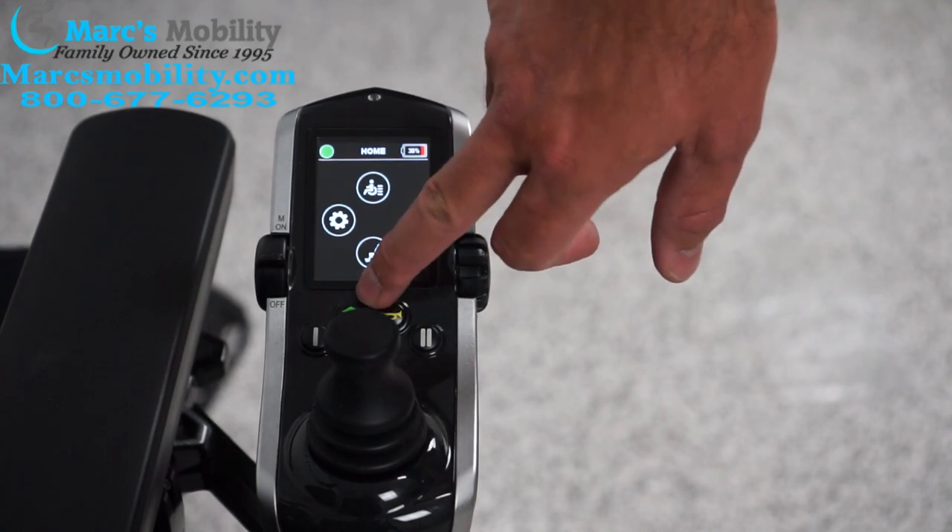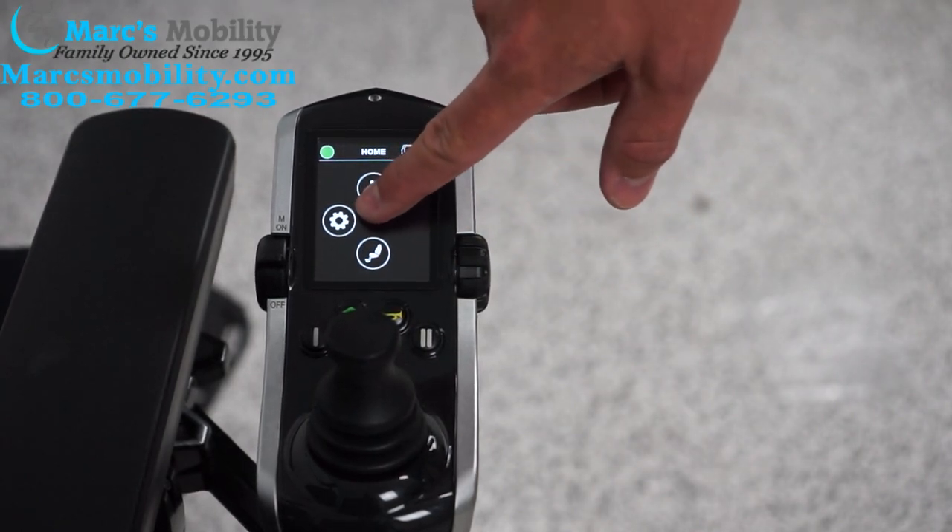You can go back to the home setting by hitting the little green home key, and from there you can go into your settings.